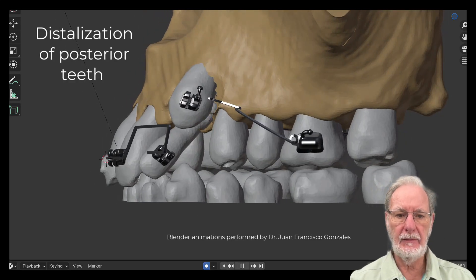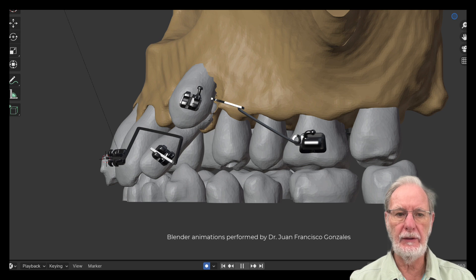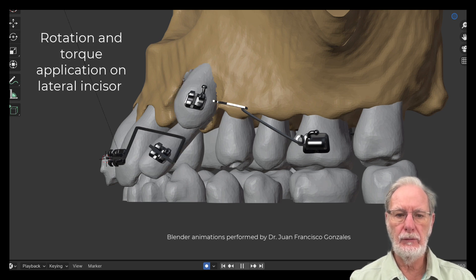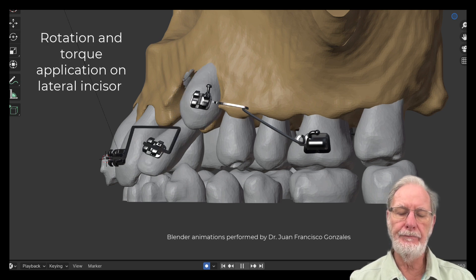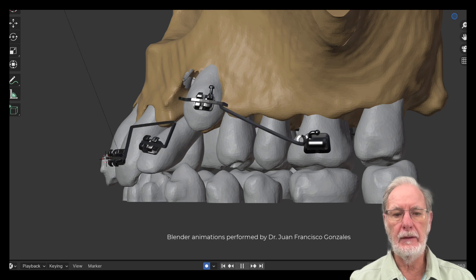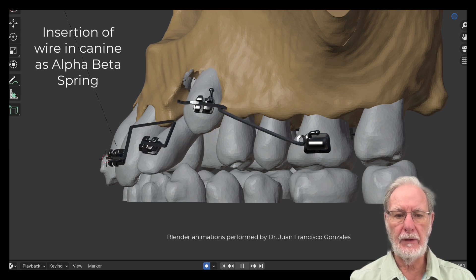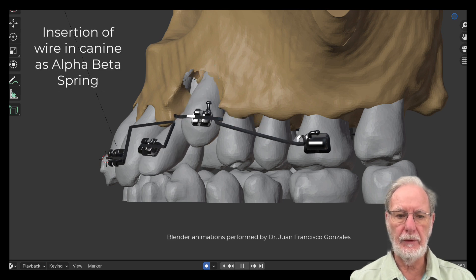At the same time we rotate and torque the lateral incisor. Then we engage the canine and torque the canine with an alpha beta spring.